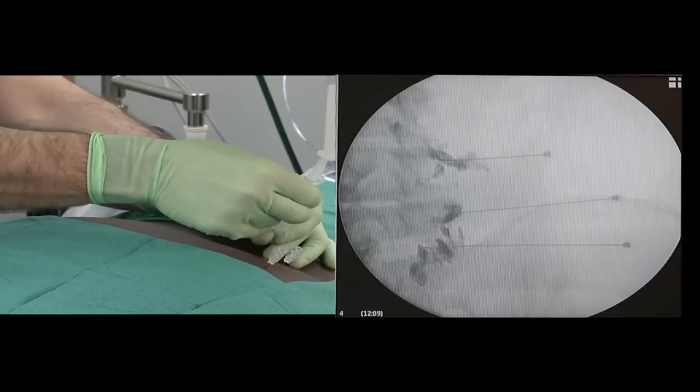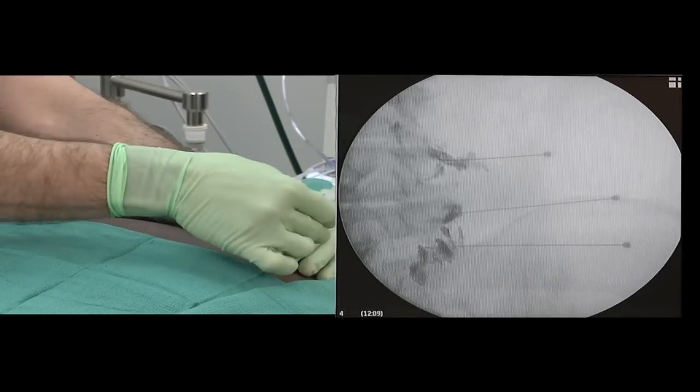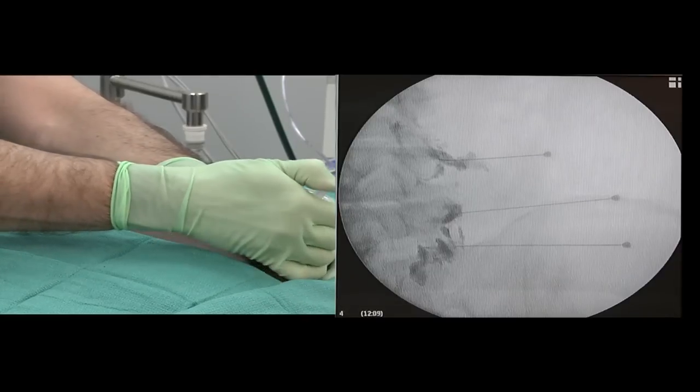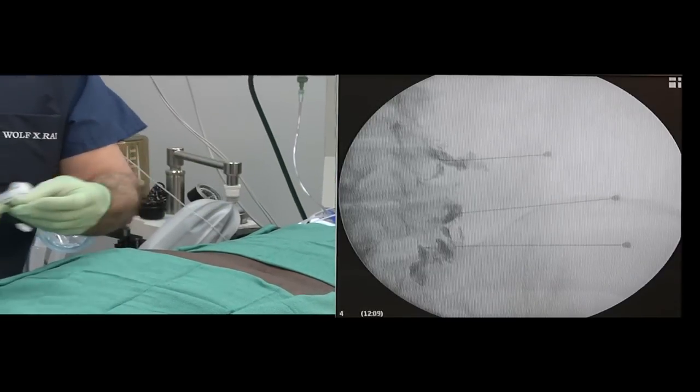The therapeutic solution is then injected through the needles and the needles are withdrawn from the patient's back. This concludes the procedure.